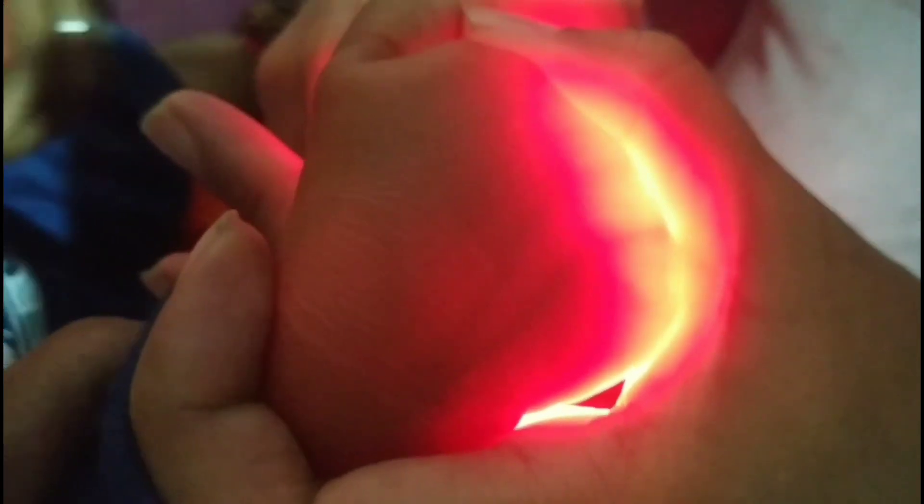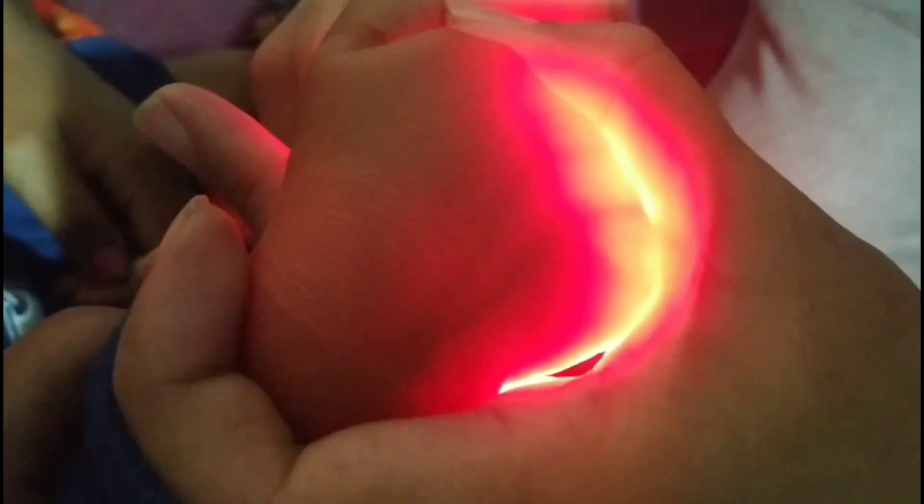So this way, by using this vein finder, we can easily fix the cannula into the baby's vein.